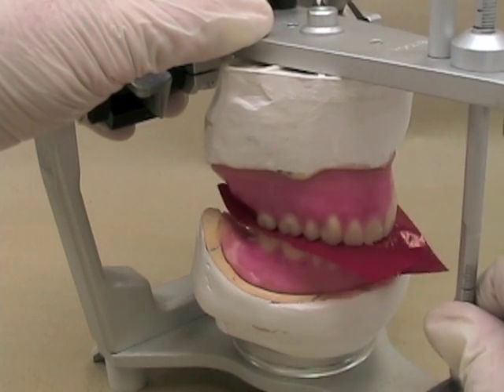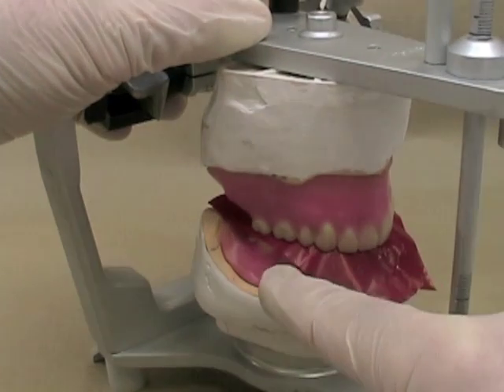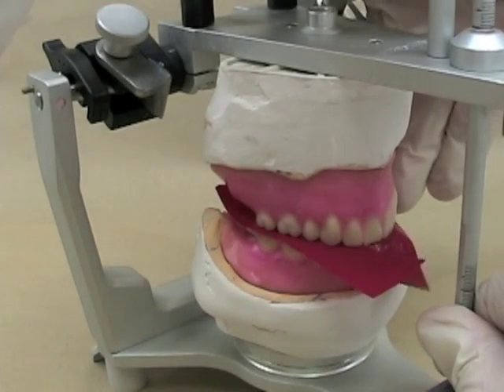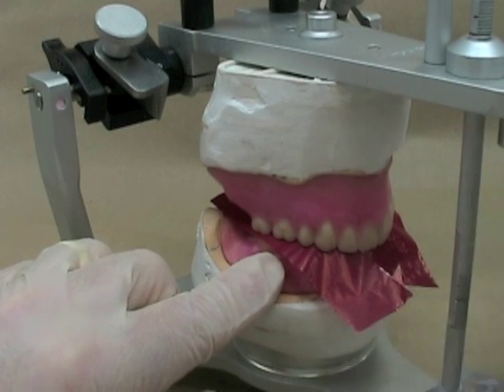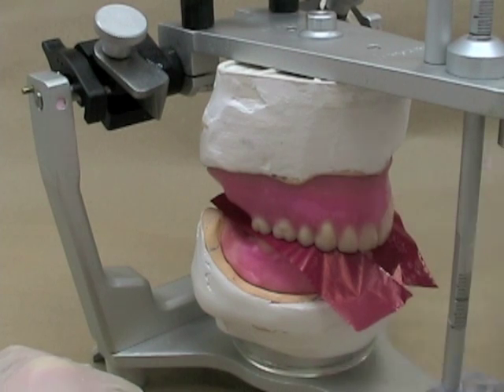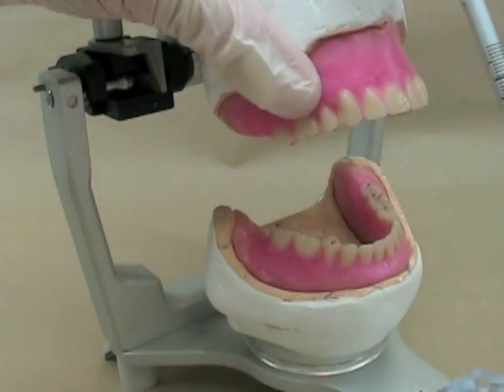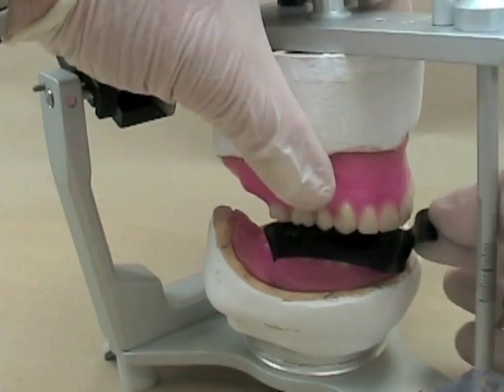For most people, you're going to find it's easier to do one excursion at a time, but you should have paper marking both on the working side — that's the side that the mandible is moving towards — and also on the balancing side. That way you'll be able to see any working contacts over here, and on the opposite side you'll be able to see if there's any balancing contacts. First we'll mark those lateral excursions, then if we've wiped out our centric stops, we'll mark those again.